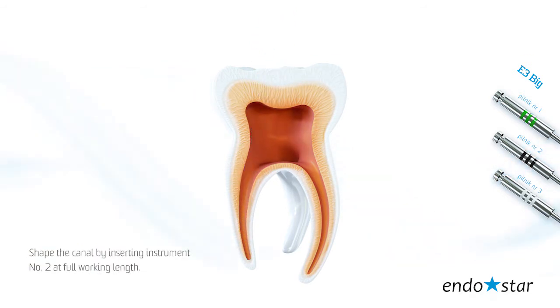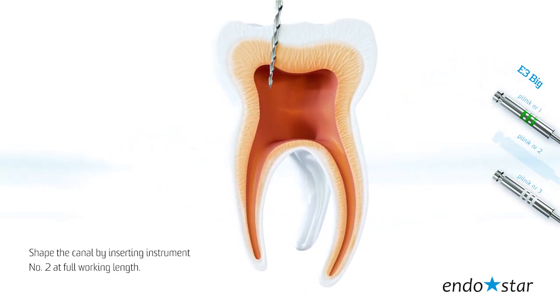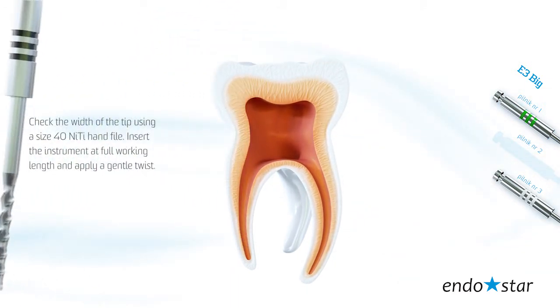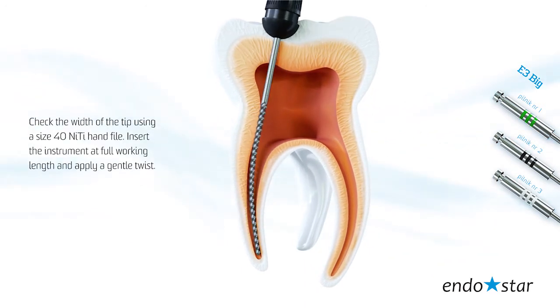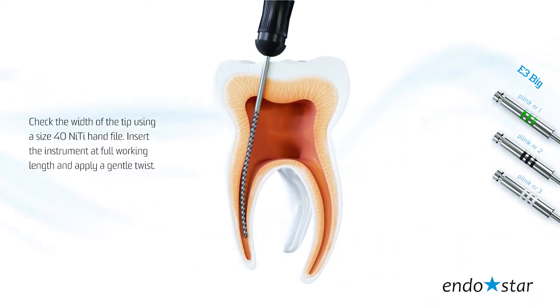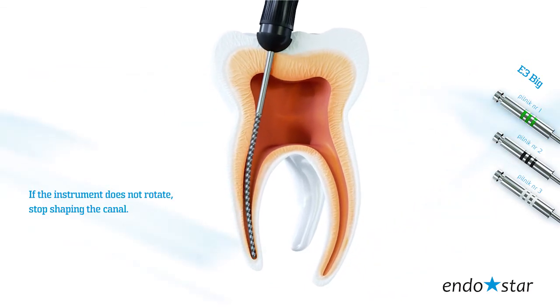Shape the canal by inserting instrument number 2 at full working length. Then check the width of the tip using a size 40 nickel-titanium hand file. Insert the instrument at full working length and apply a gentle twist. If the instrument does not rotate, stop shaping the canal.